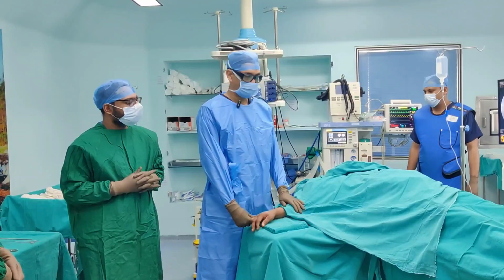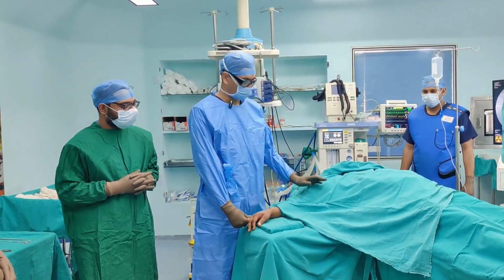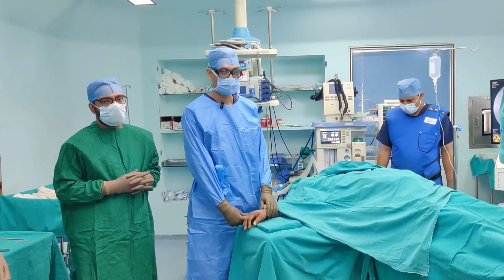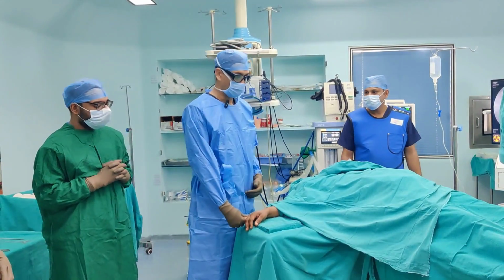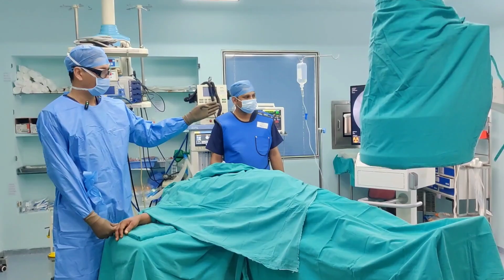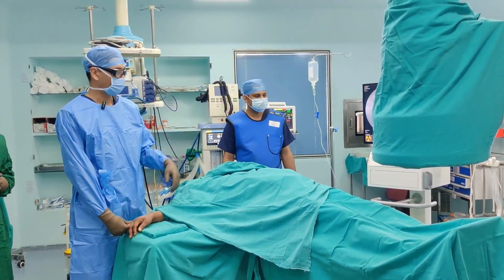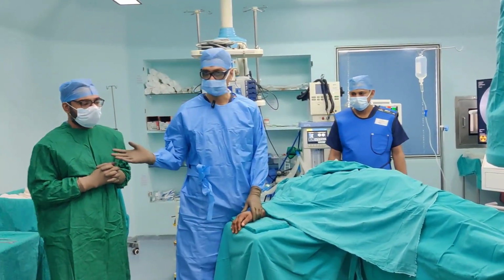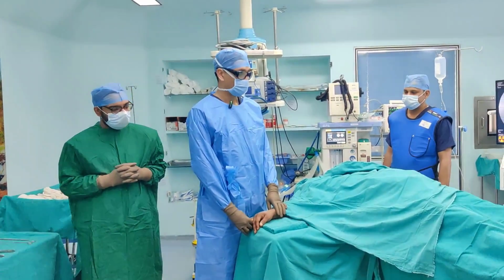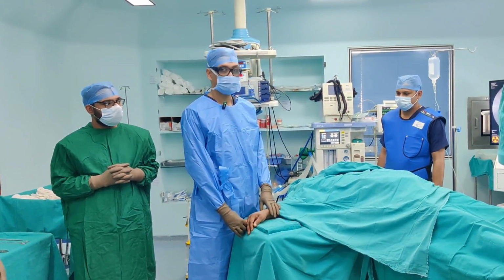So our patient is positioned, we have angled the table, we don't use any tourniquet because we are just using 2 K-wires, so I don't think a tourniquet is necessary. I'm going to sit on this side, the C-arm is going to come from the front and my C-arm screen will be on my left hand side so that I have got access to the images. My trolley is going to be on this side. So next step will be to show you how to reduce the fracture and how to pass the K-wire.